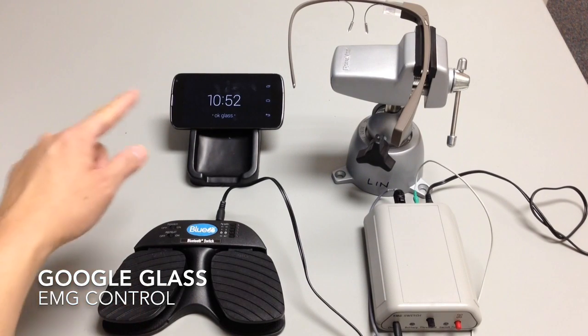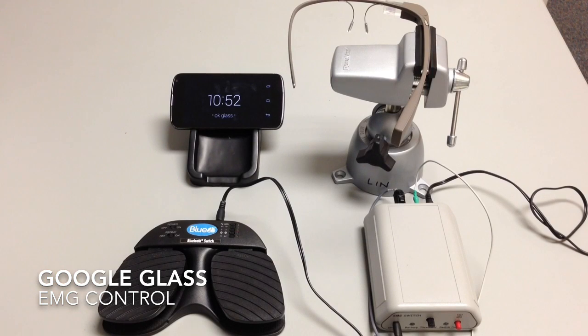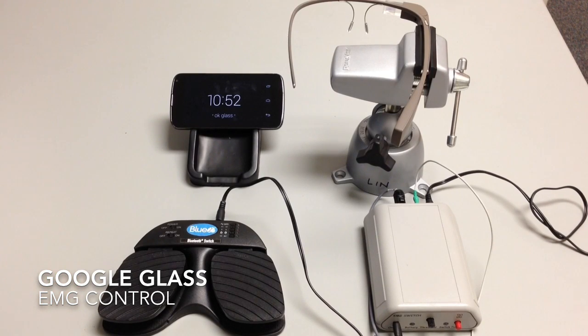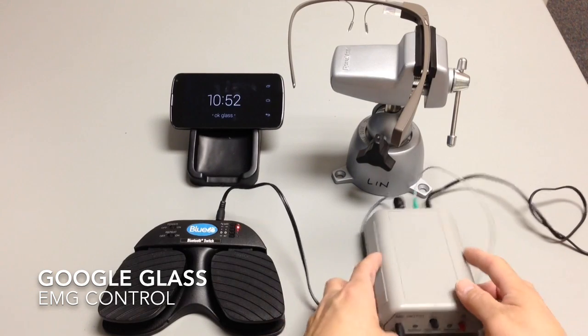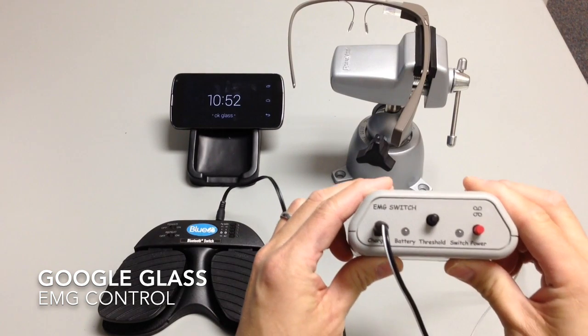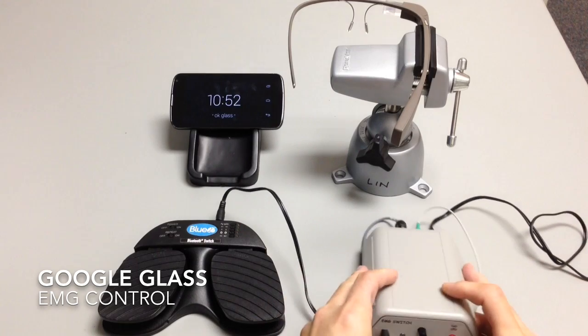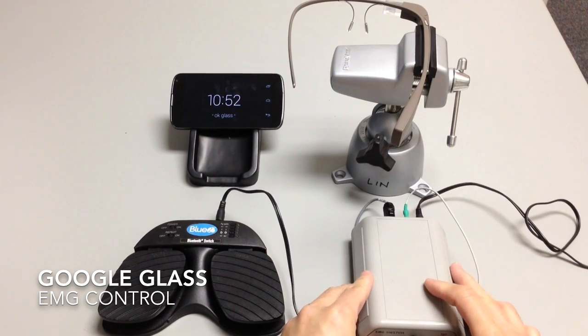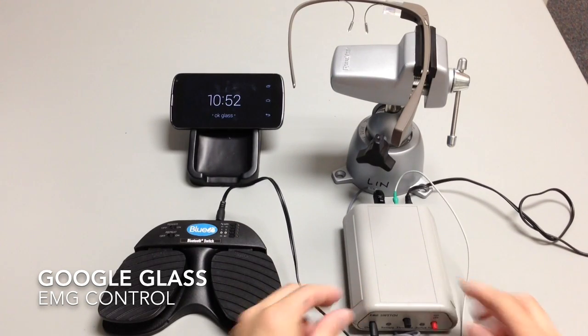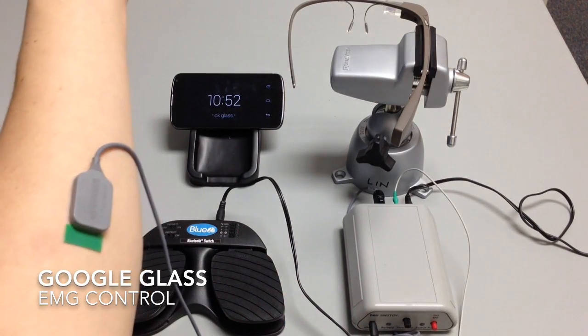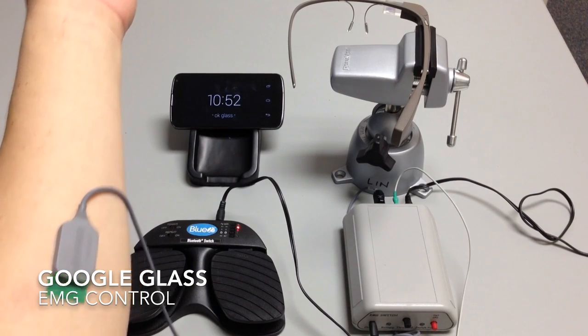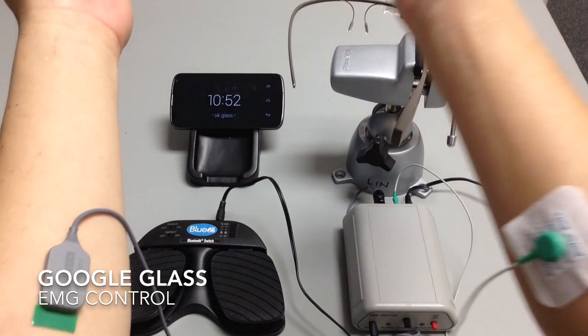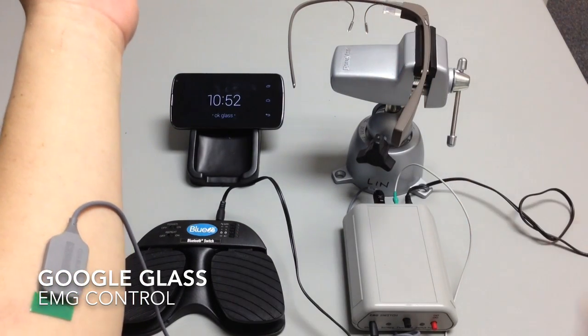This is the Nexus 4 running the MyGlass app with screencast, and this is the Tinkertron EMG switch. The lead is connected to my forearm here, and this is the reference electrode.